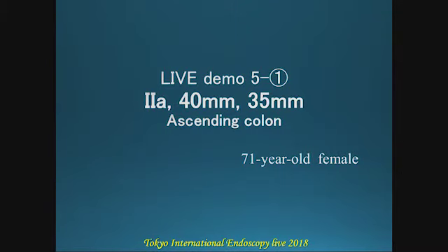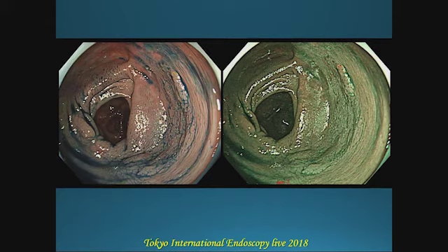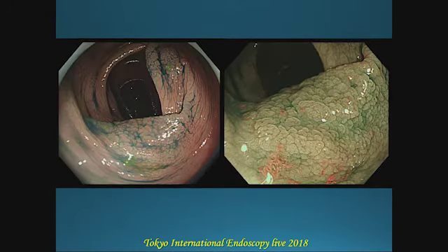The next case will be on a 71-year-old female with two lesions, 40 and 35 millimeter 2A at the ascending colon. A colonic ESD will be performed by Dr. Yamamoto.